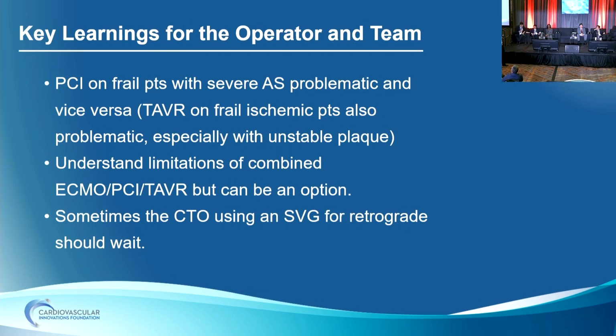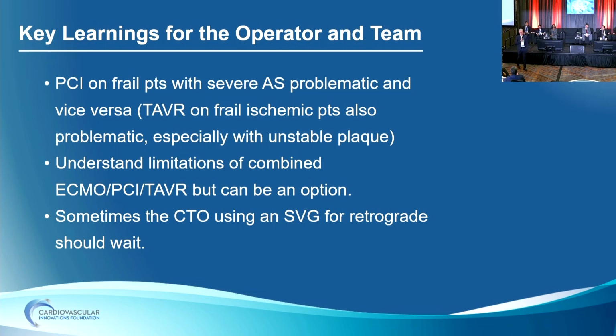Yes, Ivan. Just wondering, did your TAVR team say this was feasible other than the EF and coronary disease, as far as the anatomy to put a TAVR in? Because it seems to me, I agree with your panelists, that TAVR can be pretty straightforward if the anatomy is okay, and rather than balloon valvuloplasty, just unload the ventricle by putting a TAVR in, and that would be maybe something I would consider doing differently. Leave the coronaries, or just do the TAVR first, because you just take that off the table. If it's a straightforward TAVR, if the anatomy is fine, if the axis is fine, if the angles are fine, it's going to be like a 10-minute TAVR basically.